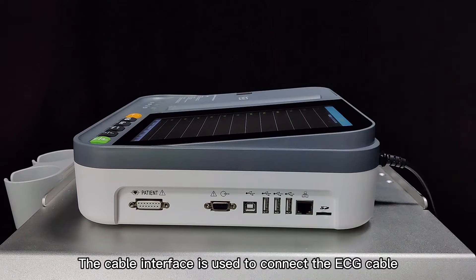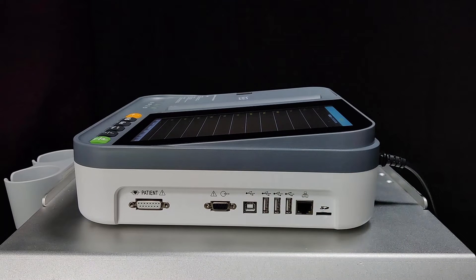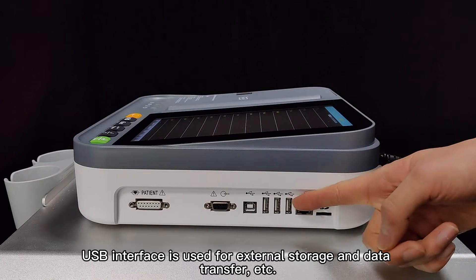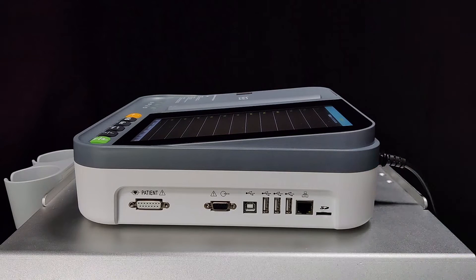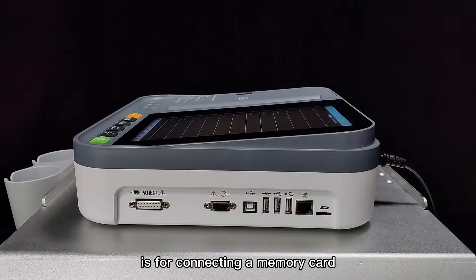The cable interface is used to connect the ECG cable. The RS232 interface and square-type USB are for connecting to an ECG workstation. The USB interface is used for external storage and data transfer. The network interface is used to connect the ECG workstation. The SD card interface is for connecting a memory card.